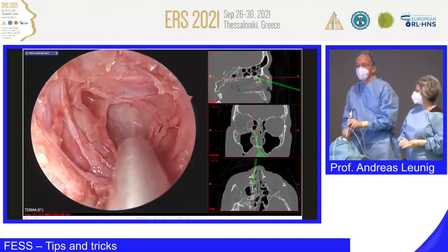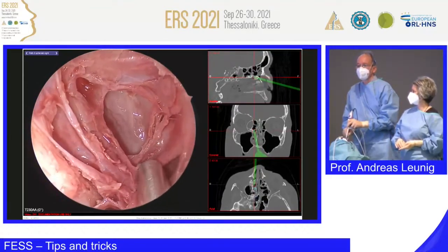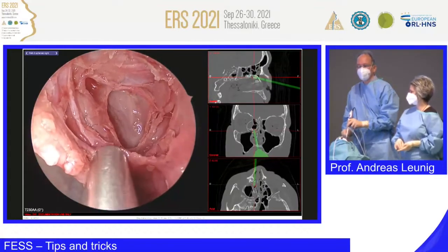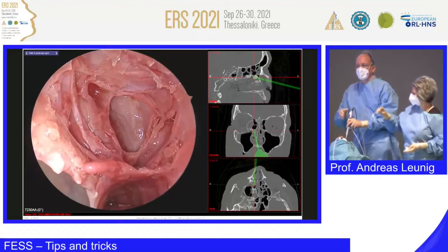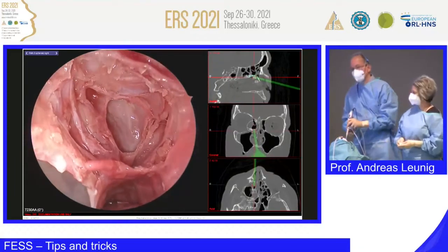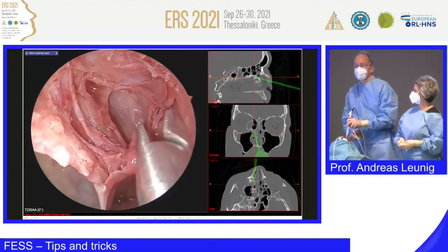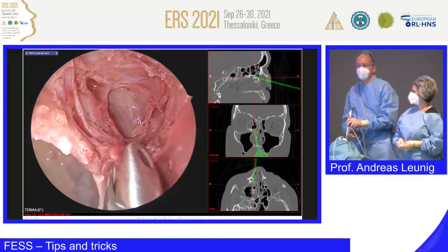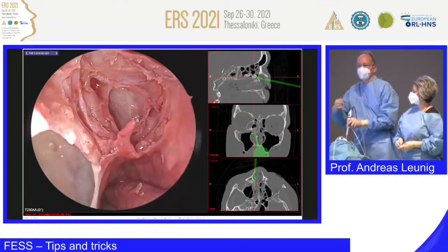Can you see here? It seems to be here. Isn't it interesting? It was not the supraturbinate. But the beauty of the endoscope is you can look around the corner. For me, it's so convincing. It's so good.